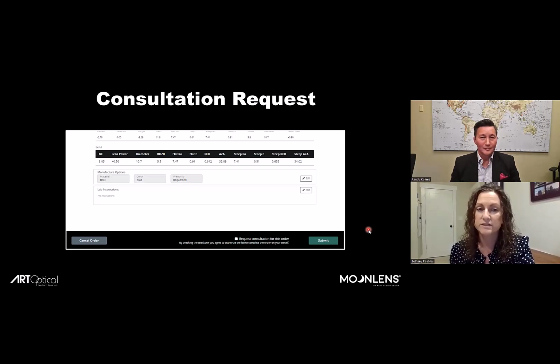Do we want to have just a conversation about, is this going to be basically a slam dunk, or are we going to maybe need to be a little bit patient if it's a high prescription or maybe it's a high cylinder? So when that box is checked, those are all things that we're automatically going to be looking at, but you can also add notes in there if there's something specific that you, as the fitter, are wondering about, then we can go ahead and take a look at that as well.